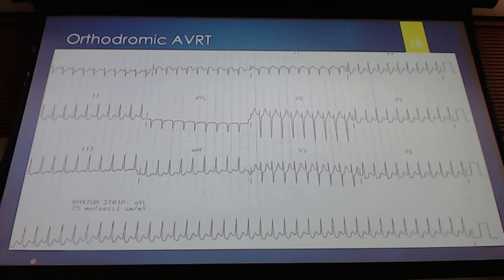So if you're in a position where you're like, I really don't know, the patient looks okay, I've got a little bit of time, we can slow that EKG down and try to identify: is this in fact a regular narrow complex? Do I see P waves or not? And that's going to help us determine what the management is for these patients. We don't talk about management in EKG, because I just need you to recognize these rhythms. You'll talk about management in cardiology.